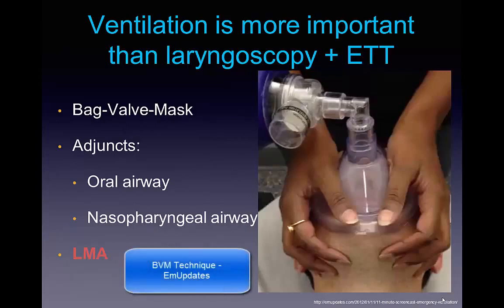And as we advocated earlier in this podcast, a two thumbs down or a two-handed technique is probably the right thing for all critically ill patients. There is a great video on this, and we've provided you a link in this video.